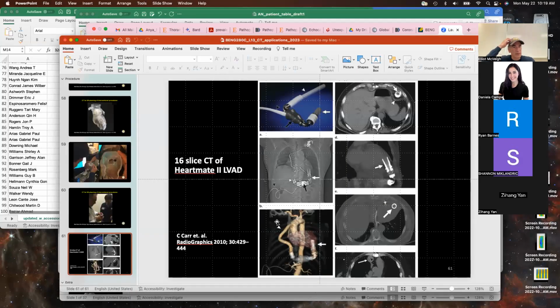Okay, I think that's it for CT applications. Again, I wanted to get through them because I think CT is going to be the principal way people image the heart maybe 15 years from now. Although I've been wrong before. I did cardiac MR for like 25 years, and it was always 5 years away from being the way everybody did cardiac imaging.